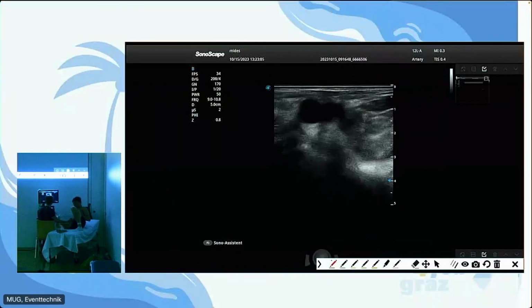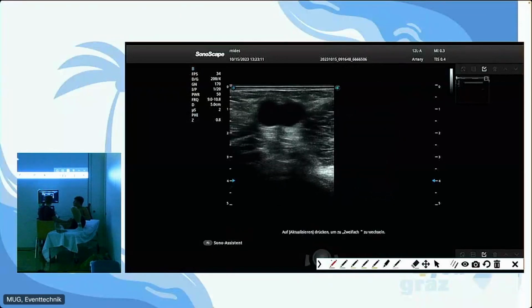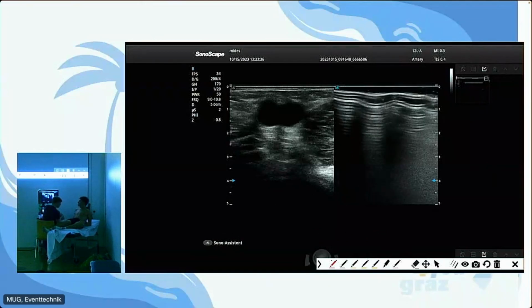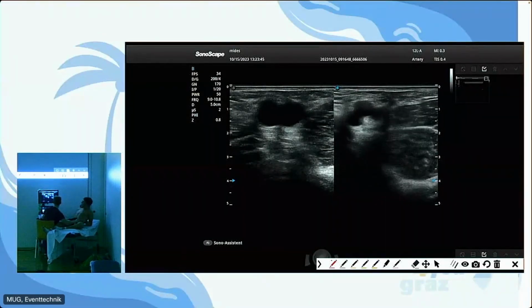Okay, yeah, you can freeze. That's the image we just saw. Right leg, probe marker laterally. But if he's going to scan the left leg with the probe marker also laterally, it's just going to be the same image. So always document your still images correctly, so that everyone who did not see the image being constructed can also identify it correctly. You see? Other leg, same image.